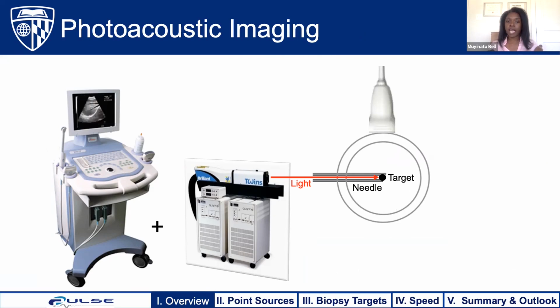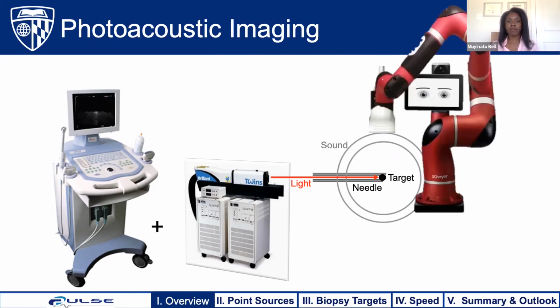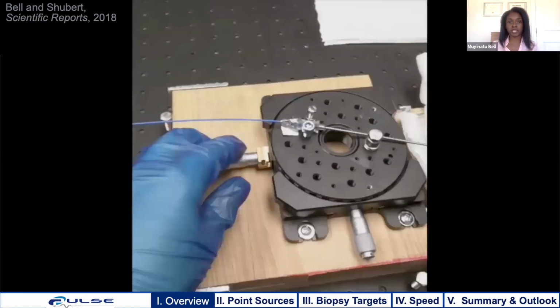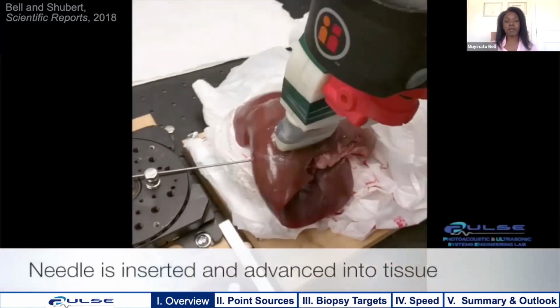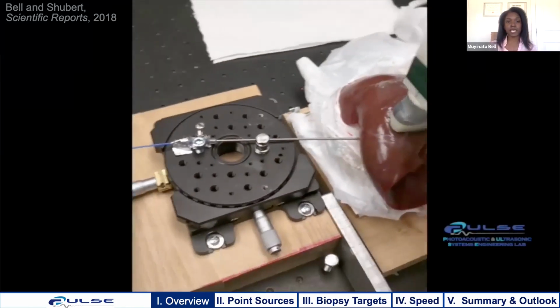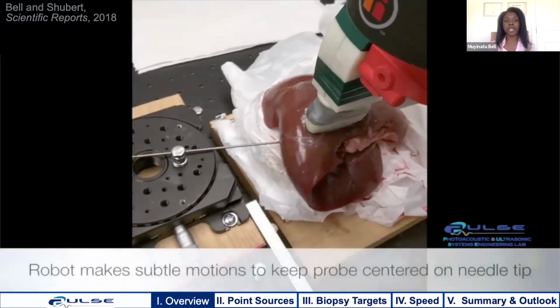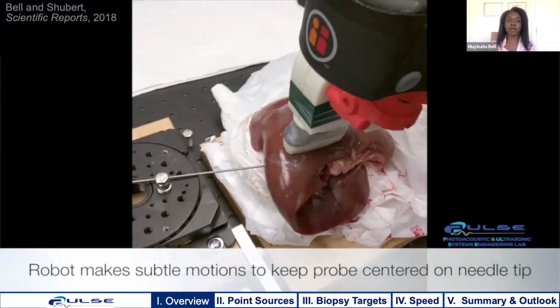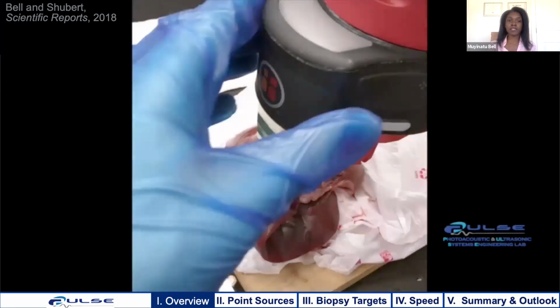We can also relieve the operator from manually searching for the photoacoustic signal within the larger ultrasound image by attaching a robot arm to the ultrasound probe. And we call this entire system our photoacoustic-based visual servoing system, and we tested it in a controlled experimental environment to visual servo a needle tip, which houses an optical fiber and is rigidly attached to a translation stage that you see here, and is used to advance the needle into this ex vivo tissue, while a robot-held ultrasound probe is commanded to stay centered on the needle tip.